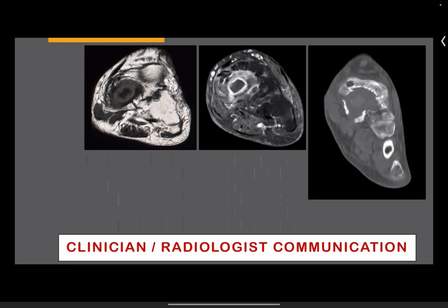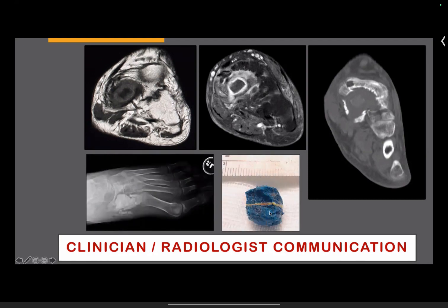And then the clinician came back to me and they found this. They found a rubber foreign body because the patient had some injury. He was wearing some flip-flop. It went in a few years back, and lo and behold. So again, that two-way traffic is very important to kind of build that experience so that when you are dealing with unusual things, you are a bit more confident.